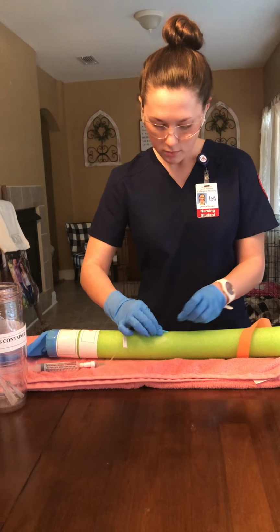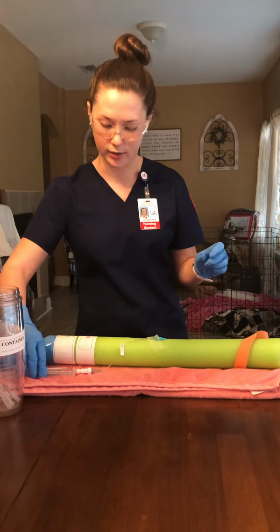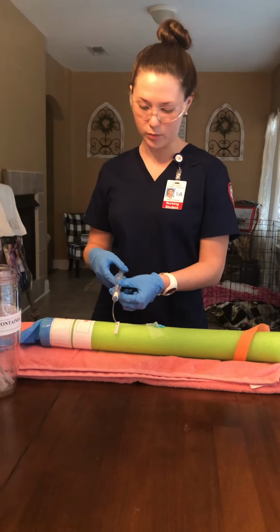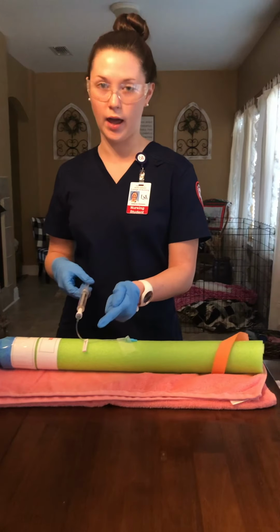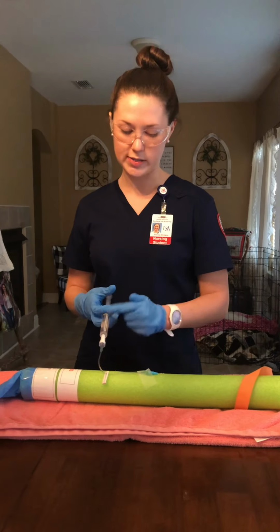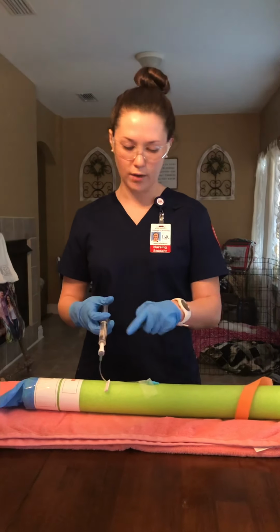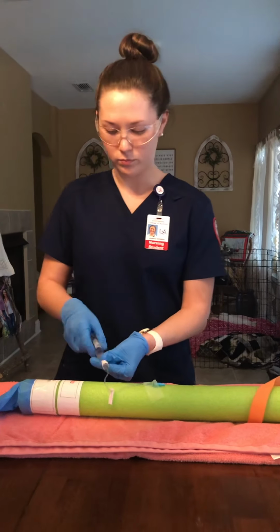So now that it is secured with tape, I would want to assess for blood return again. So I would actually aspirate back, and I would make sure that blood came through the tubing right here. And then I would want to flush the rest of the saline into the vein. I would be looking for swelling while I did this. Whenever all of the fluid has gone in, I would remove this and dispose of that in a sharps container.